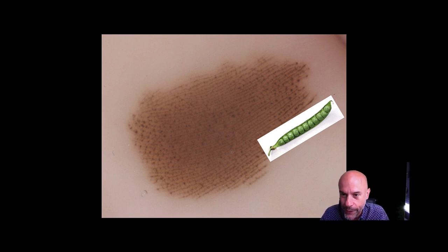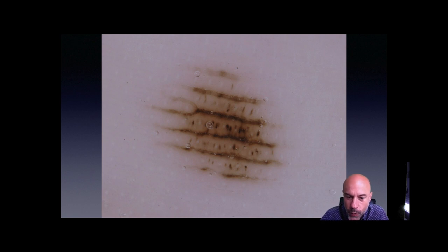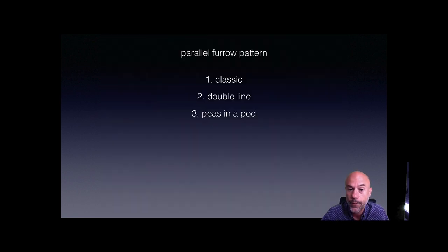'Peas in a pod' is a metaphoric term used to describe this pattern, and it is associated with congenital acral nevi. One more example at higher magnification: the pattern is parallel furrow. The pigmented lines are located on the furrows, and on the ridge we can see brown dots located precisely on the openings of the eccrine ducts. Peas in a pod is the third variation of the parallel furrow pattern.